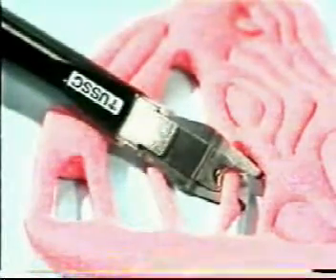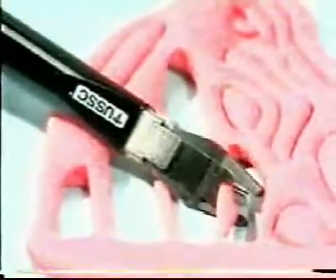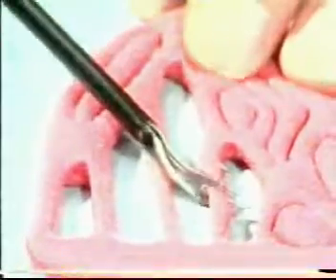First of all, practice using a clip applicator outside the simulator. Insert 3 clips onto one of the limbs of the foam tree and then cut between them like this.